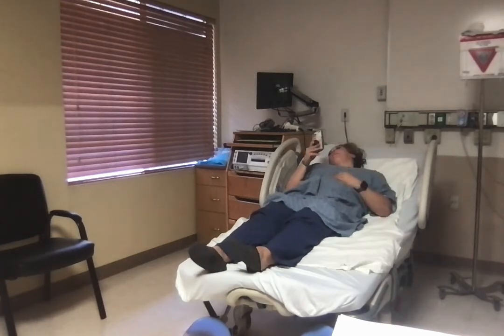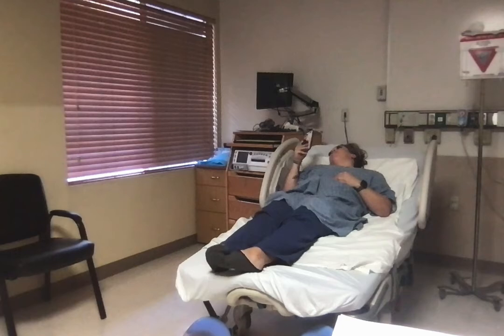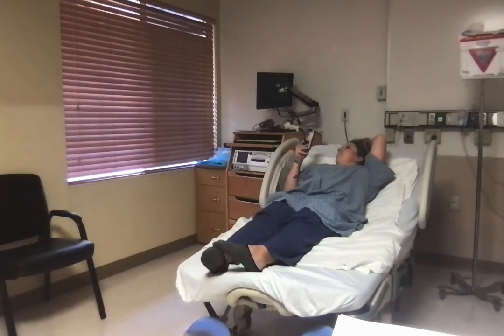In the last 10 minutes, the nurse has noticed the fetal strip showing recurrent variable decelerations with moderate variability, which is a category 2 finding. The nurse enters the room to begin interventions and intrauterine resuscitation measures in an attempt to bring the fetal heart rate back up to a category 1. The nurse enters the room and performs hand hygiene.